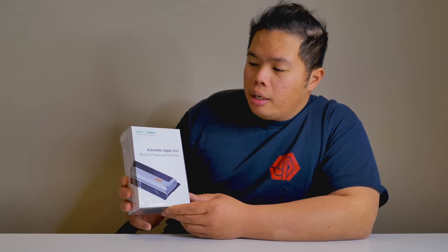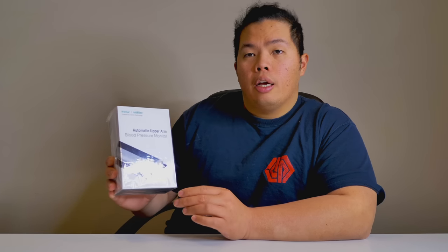Without further ado, let's look at this. This one is an automatic upper arm blood pressure monitor. For those of you who need this a lot and for those who want to track it at home, this can also be connected to your smartphone. Today we're going to test that out and see how well it does.